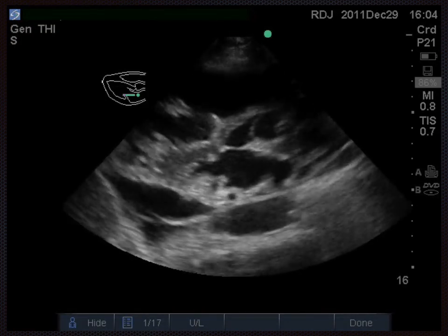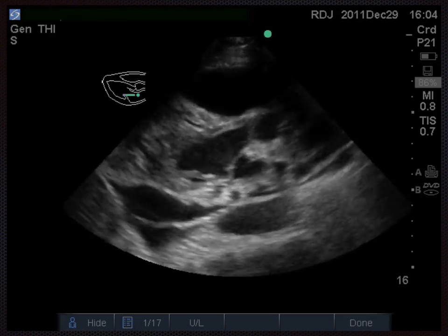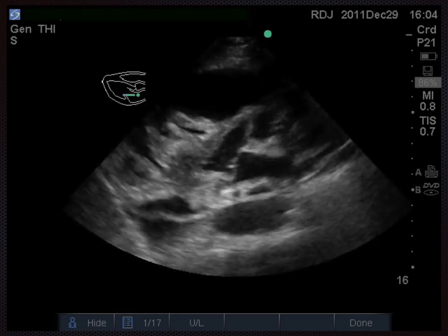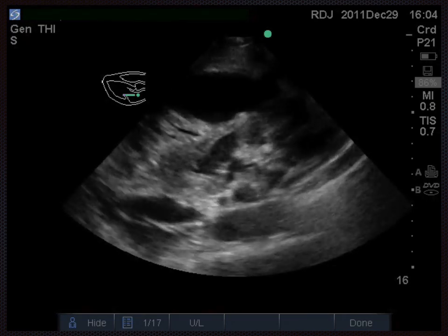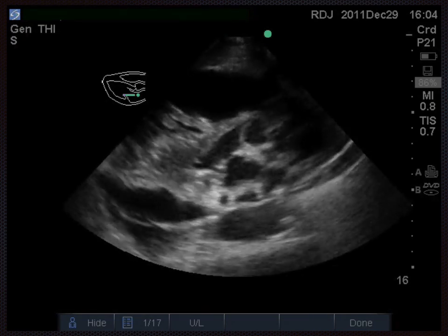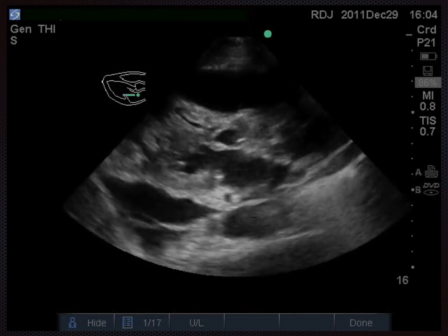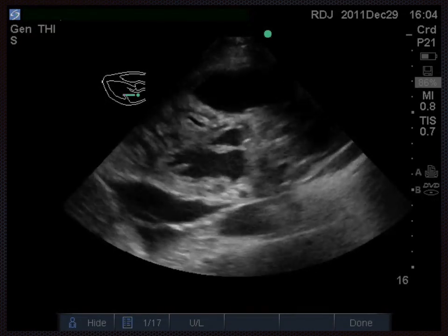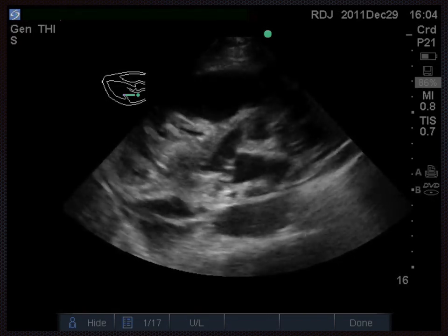Trying to look at the part you can see in a relaxed phase can be challenging, but there may be slight thickening seen here, but at least you can make an assessment of the normal non-thickened state and see whether or not you think it's normal. So I think this is probably slightly thickened.